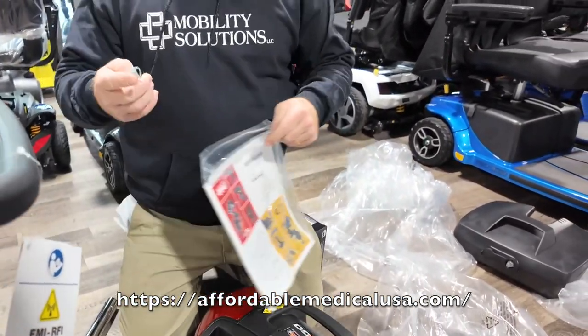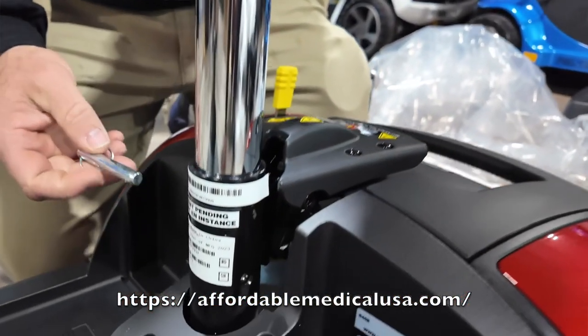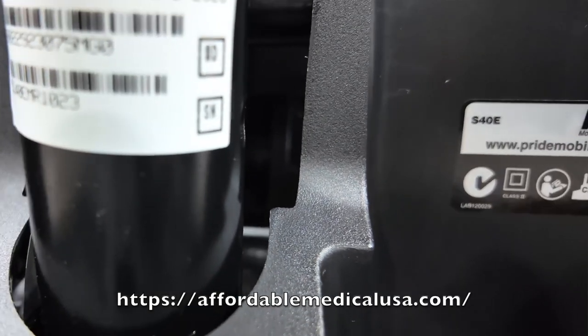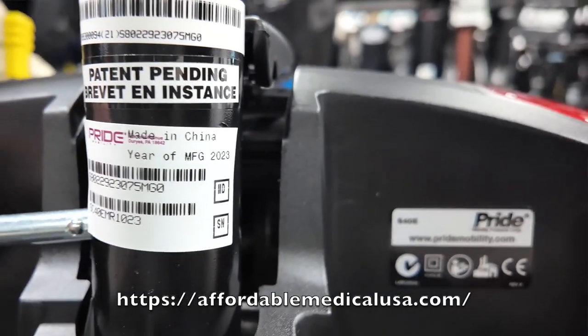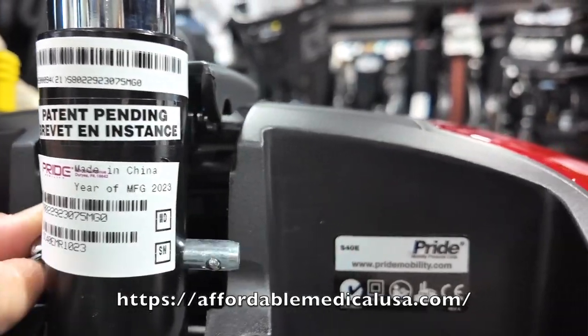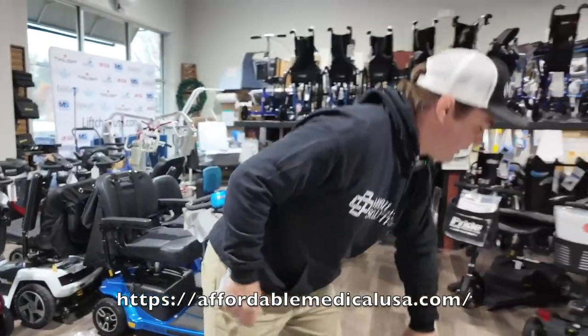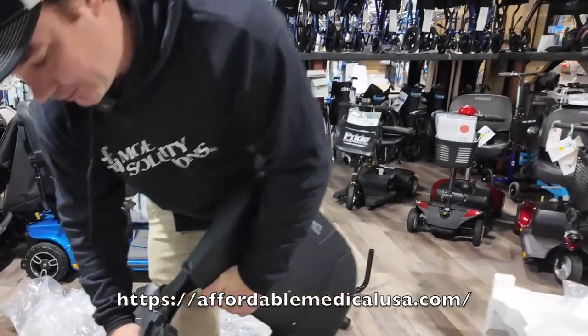Take your pin, pick it out, and put it in here — it just goes across. You can determine which hole you want based on your seat height, depending on how tall you are. Then grab the seat and drop it right on.